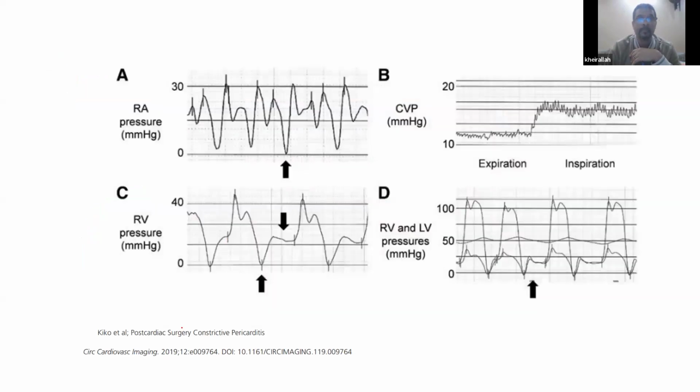Now look here, just again, one last time at this part. This is CVP. Look at the CVP during expiration and during inspiration. What do you notice?